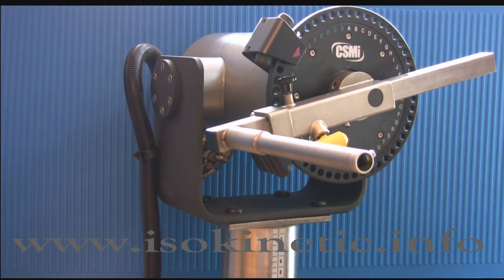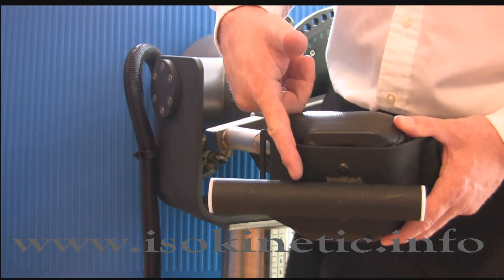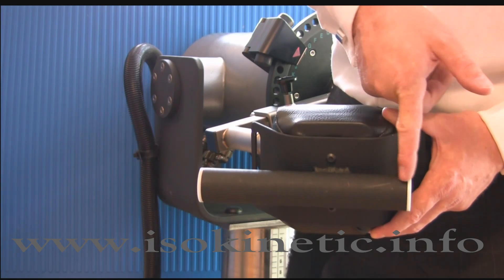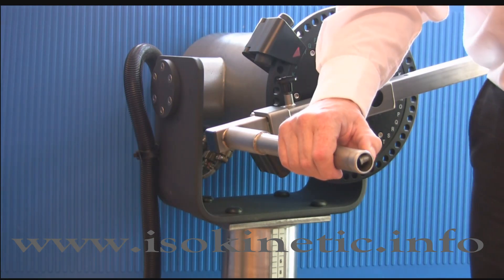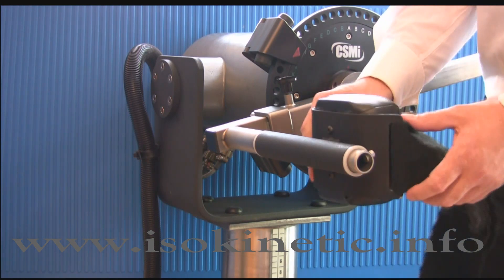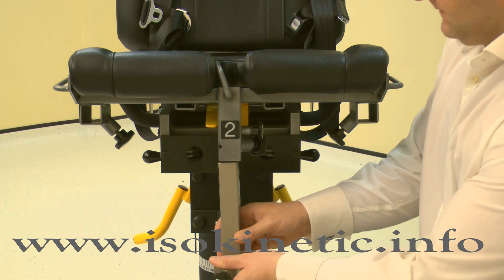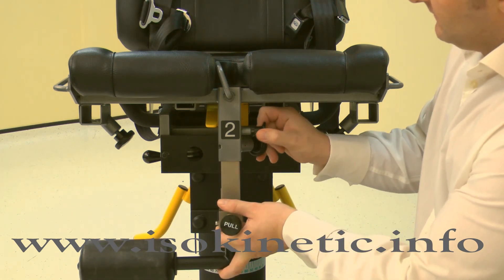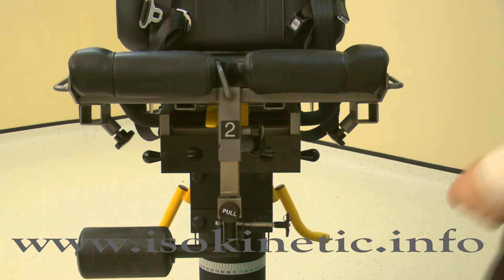To attach the knee hip pad to the knee hip adapter, first choose to use either the long or short end — the different lengths account for TBL offset. Press the retaining button on the knee hip adapter, then slide the pad into position. If required, insert the contralateral limb stabilizer into tube 2. Ensure the stabilizer is facing the limb not being tested. Pull the locking pin to adjust for height, then secure with the screw handle.